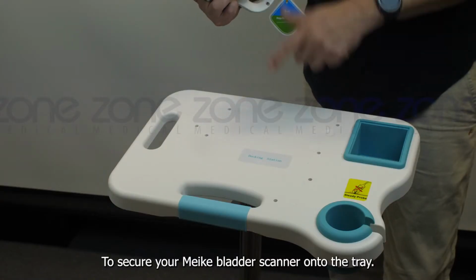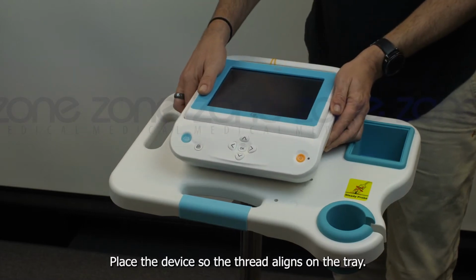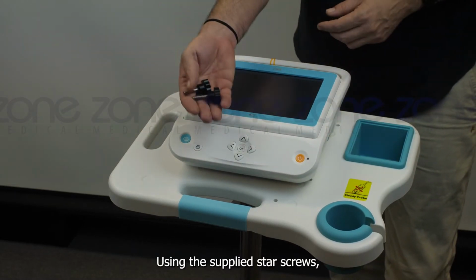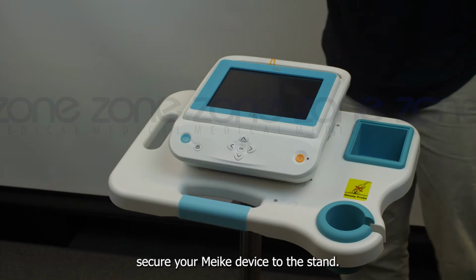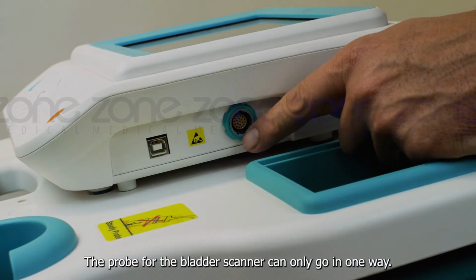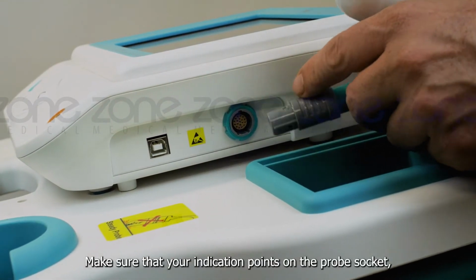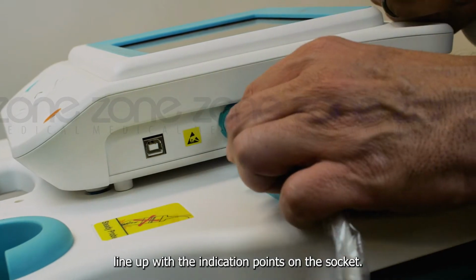To secure your Meike Bladder scanner onto the tray, place the device so the thread aligns on the tray. Using the supplied star screws, secure your Meike device to the stand. The probe for the Bladder scanner can only go in one way. Make sure that your indication points on the probe socket line up with the indication points on the socket.